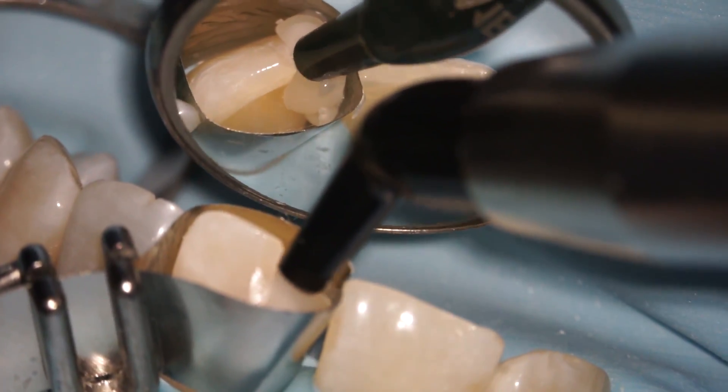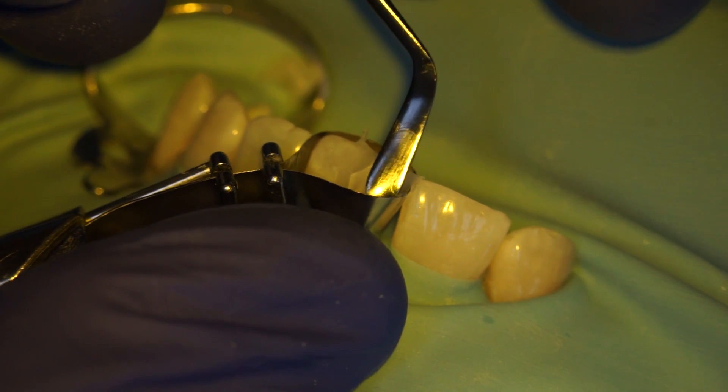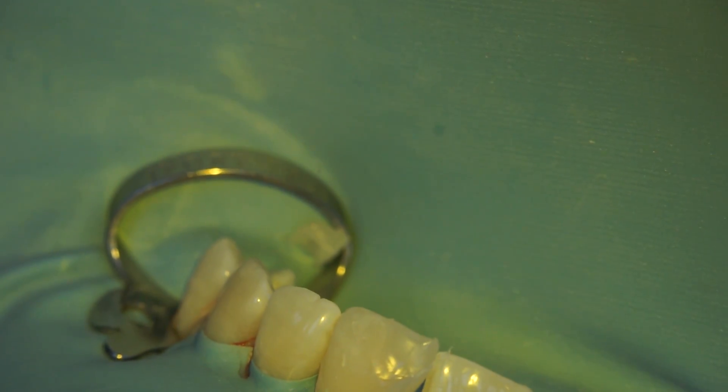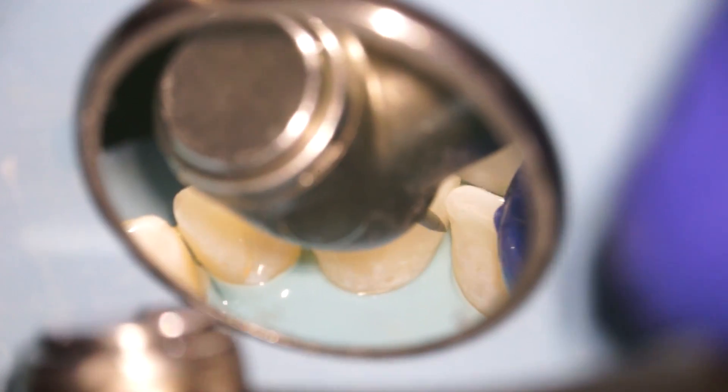Here we are building the rest of the tooth up. We just spend time shaping it, making sure that it looks like a tooth. We don't need to get it perfect yet because we're going to cut it back later, but we get it very, very close to where we want it to be. We set it with the light, remove the band, and now we just spend time refining the tooth, making sure that it looks as much like a natural tooth as possible.